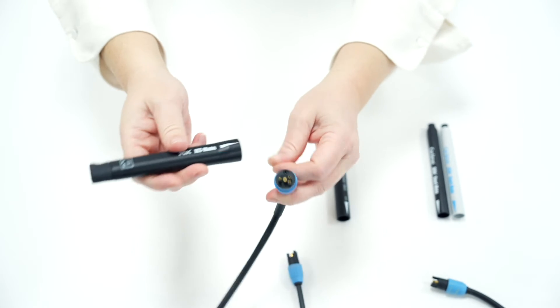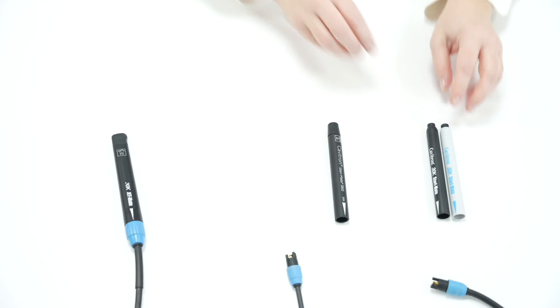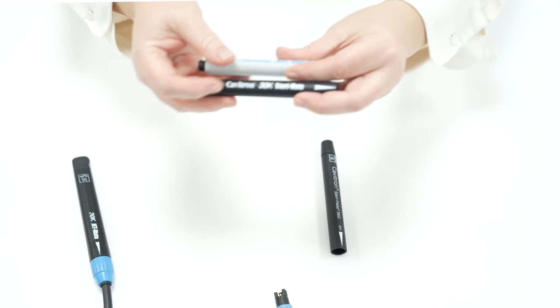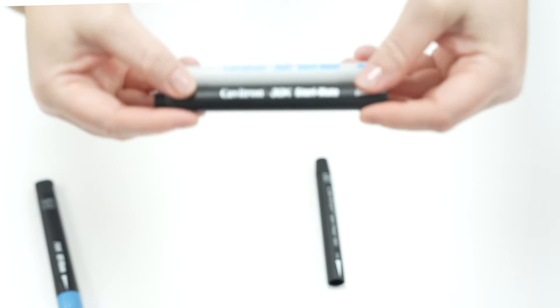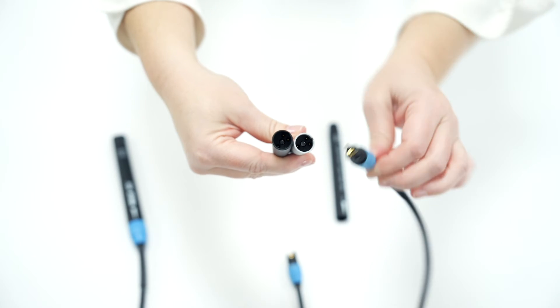The Jetmate is for our Cabotron to allow you to have prophy and scaling because it has air and water flow. Here is a standard Stereomate that connects to most analogue 30k Cabotron units. These Stereomates can be bought in black and grey, and they both have the same fittings so will connect to the handpiece cable.